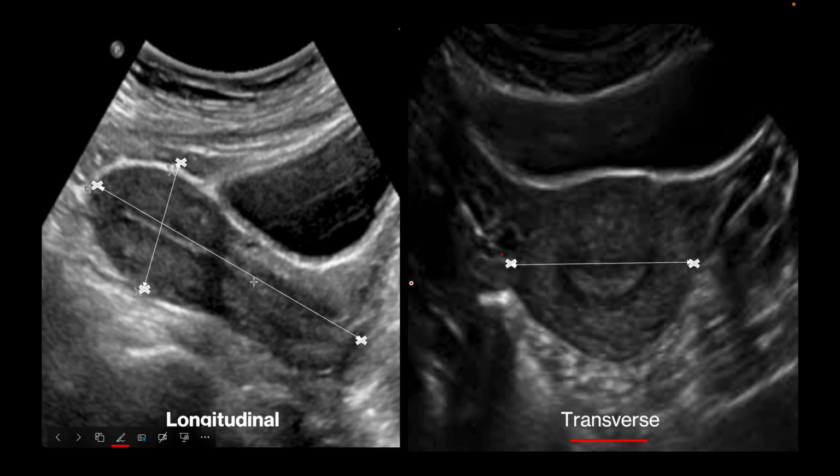Uterine cervix length is measured in the mid-sagittal plane from internal os to the external os. Cervix extends from external os to internal os. Internal os is the point where the cervical canal opens into the uterine cavity. Similarly, external os is the junction between vagina and uterus.